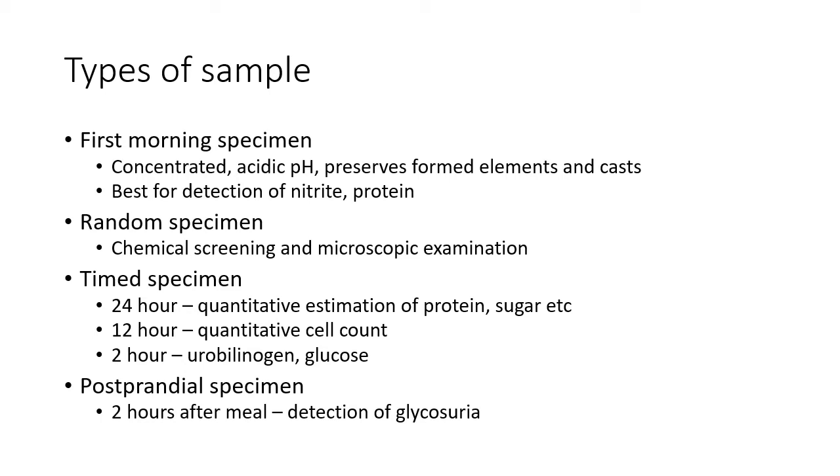Random specimen is the most convenient, which can be collected anytime, and this is ideal for chemical screening and microscopic examination.